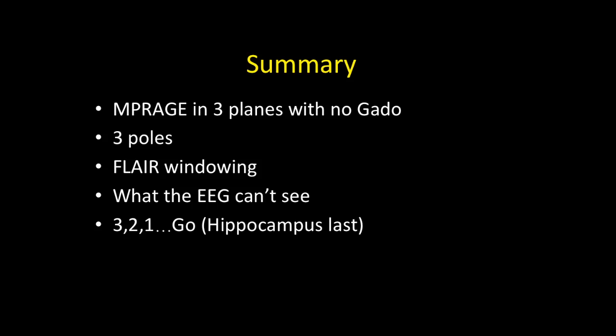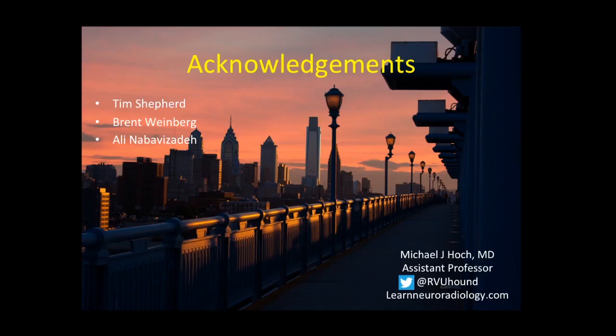To summarize the search pattern: T1 MP-rage first in three planes — sagittal midline, sagittal perisylvian, coronal ventricles, coronal three poles (frontal, temporal, occipital), then axial global view. Then FLAIR at two window settings — correct and aggressive — on axial and coronal. Don't forget to look where the EEG can't see: cingulate gyrus, insular gyrus. And then three, two, one — go to the hippocampus last. Thanks.